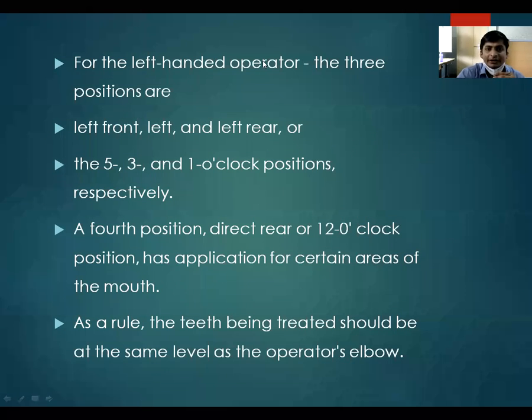Moving on to the left-handed operators. Most of us are right-handed, but for the left-handed operator, there are three positions: left front, left, and left rear. Also called 5 o'clock, 3 o'clock, and 1 o'clock position respectively, same as for the right-handed operator. The fourth position, a direct rear or 12 o'clock position, has applications for certain areas of the mouth.